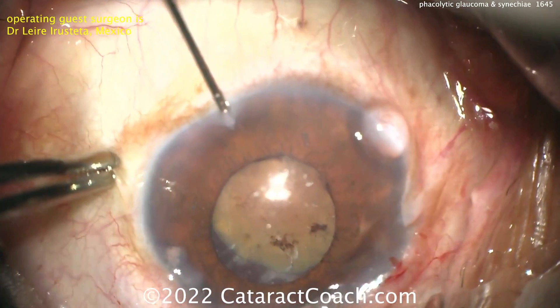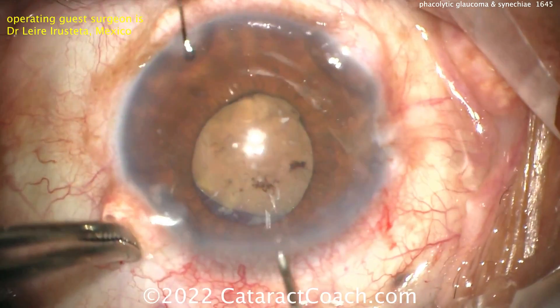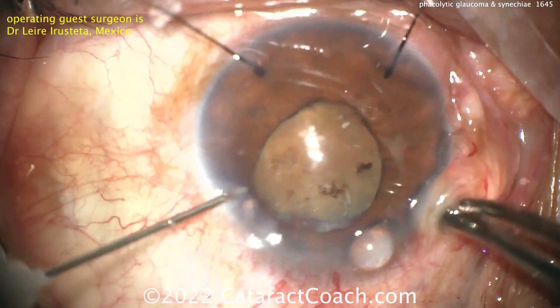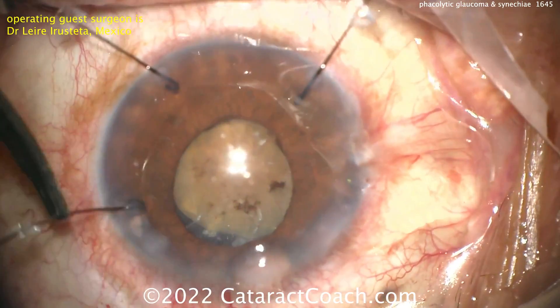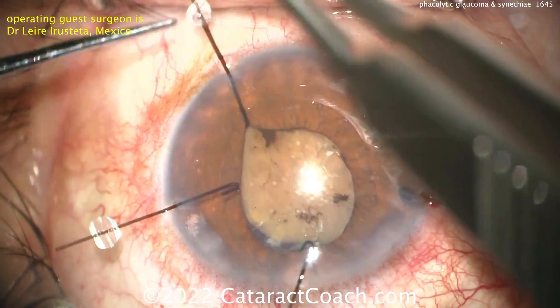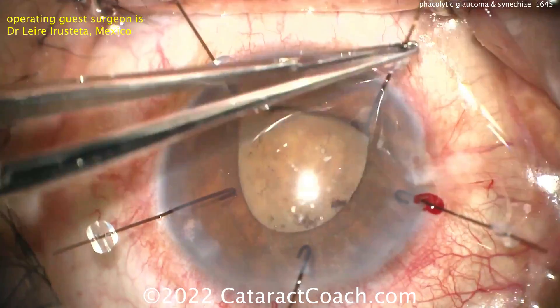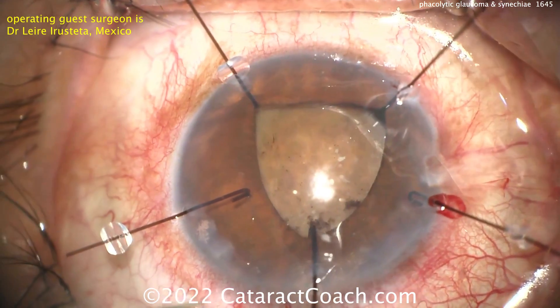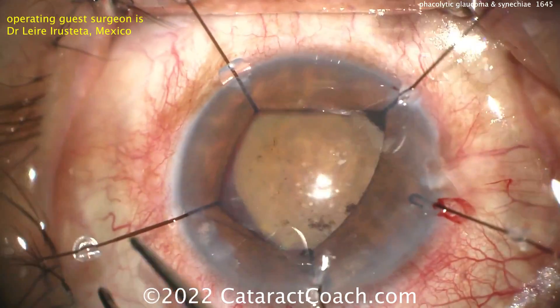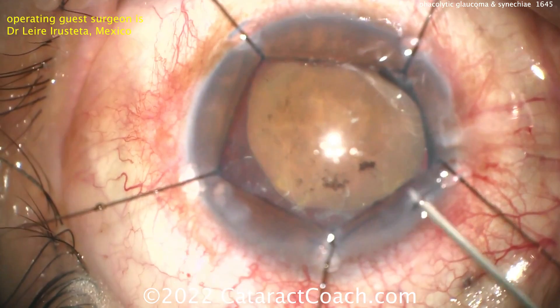Making a few small entrances here, probably for some iris hooks — interestingly, making those with just a needle. That's a very interesting technique because you don't need a paracentesis that's one millimeter wide; these hooks are smaller than that. I actually like that technique; I've not tried that before with a needle — I usually use the paracentesis blade, but I'll try it next time. Now getting the iris hooks in — I like the positioning of five iris hooks, as it gives a little more exposure, especially in that sub-incisional space where you're going to make your faco incision.